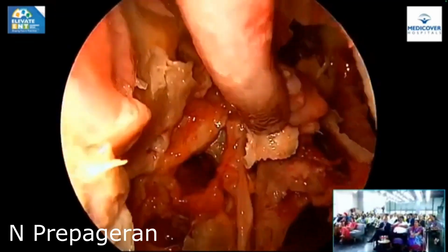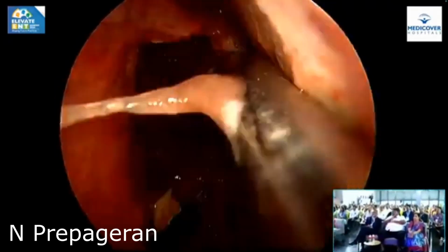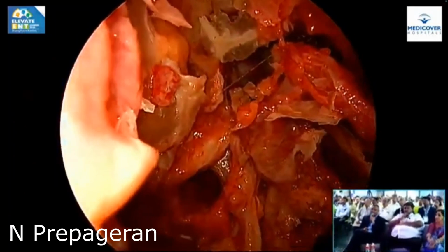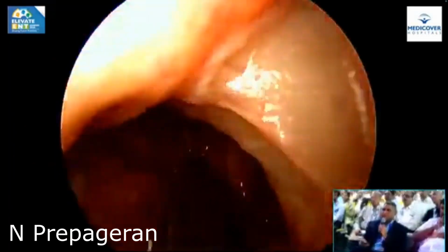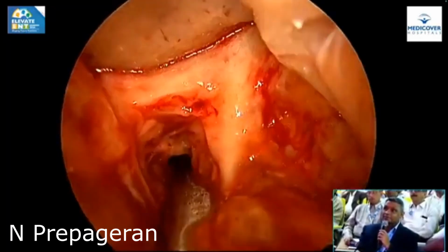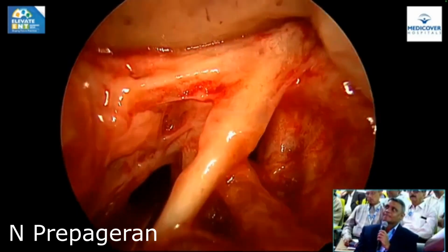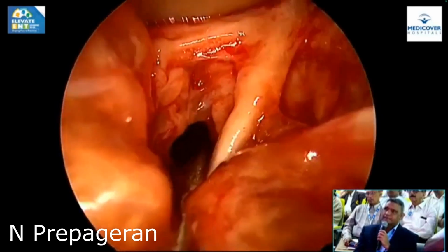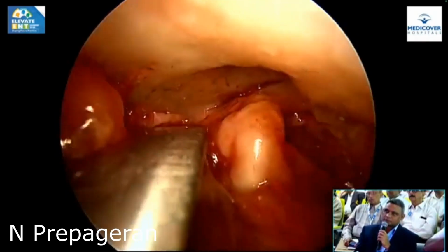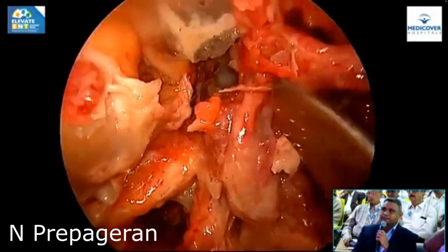Sir, so now we go to skull base. Sir, the level of parapharyngeal ICA, one delegate wants to know about that. The parapharyngeal ICA. To reach the parapharyngeal ICA, we have to dissect much more. We have to go beyond this. If you continue your dissection behind here, you will actually come to the middle meningeal artery, foramen spinosum. So your artery is way too far to the back. The ICA will be way at the back here. Here, beautifully, you can see foramen ovale with anterior and posterior branch. You continue your dissection, you will have middle meningeal artery and foramen spinosum. Your ICA will be at the back here. Yes, far posterior.